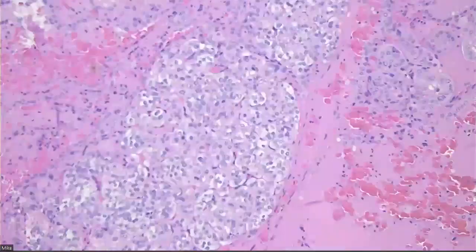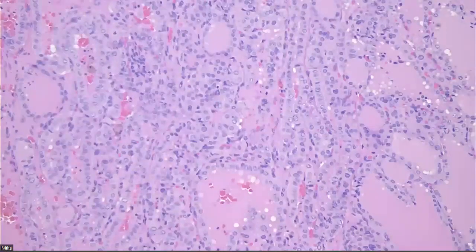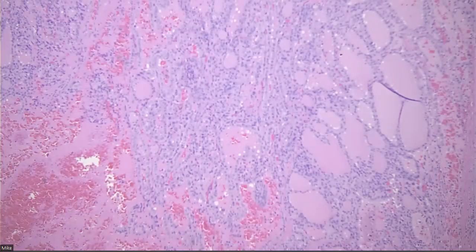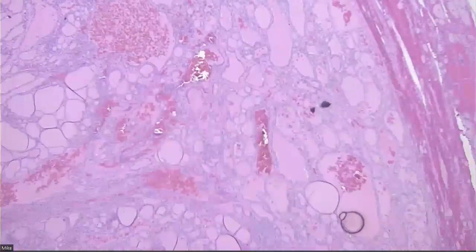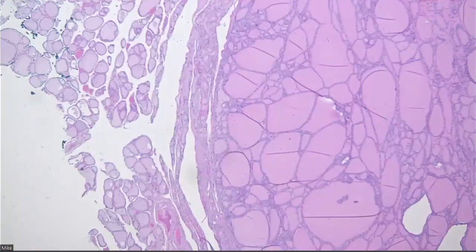And this is why we're getting away from the nomenclature of hyperplastic nodules or colloid nodules, because even the ones that look, quote unquote, macrofollicular or maybe hyperplastic, you cannot tell based on looking at them.